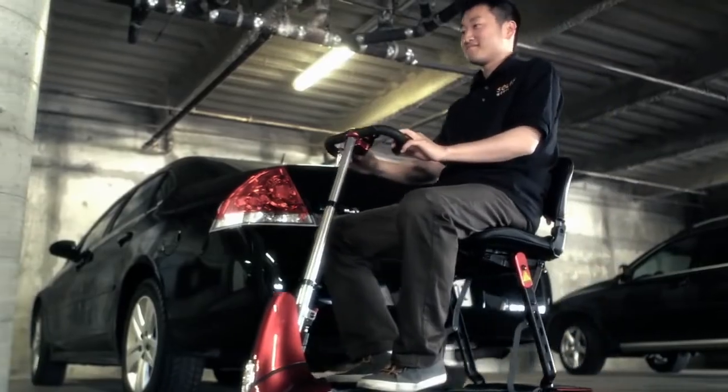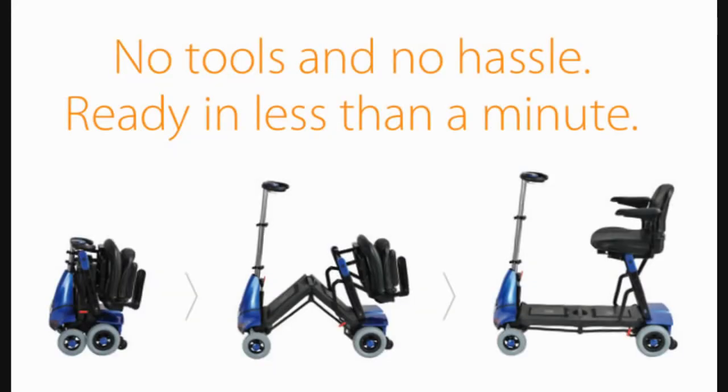The Mobi is designed to support a weight capacity of up to 300 pounds. It further enhances your mobility through a battery backup system that allows you to go twice the distance.